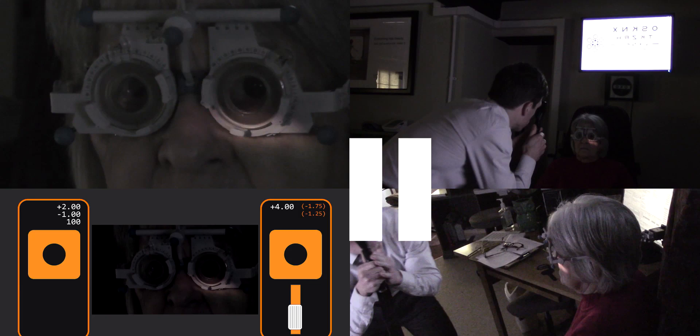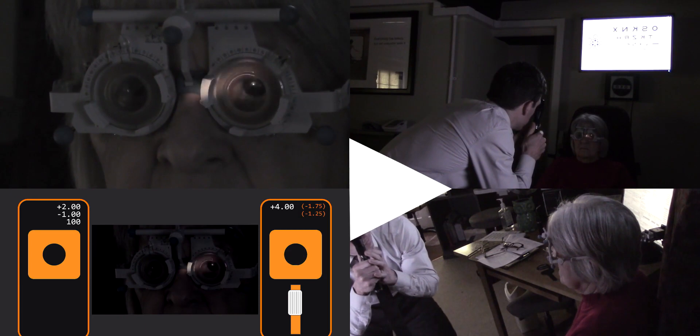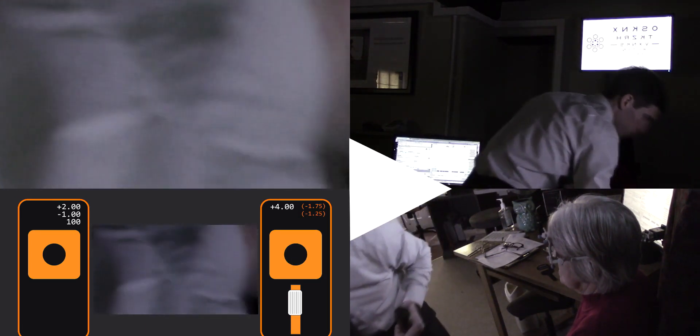It always made me smile when I was teaching at the university — the students were taught to put a plus 1.50 working lens in the back cell of the trial frame right at the start of the retinoscopy. This is not really recommended as it means that your spheres will be at the wrong back vertex distance because they are not in the back cell. Now onto the left eye — he quickly reverses the streak. The horizontal sweep maybe shows a slight with movement and the vertical sweep much more of a with movement, pretty much like the other eye.